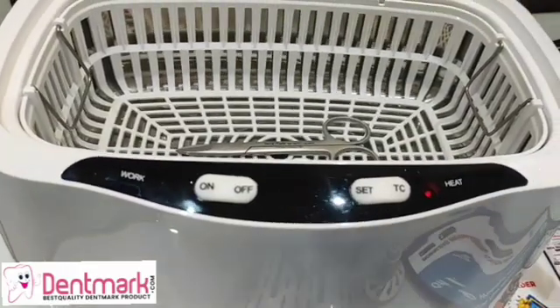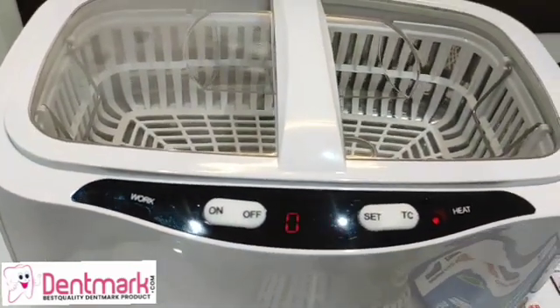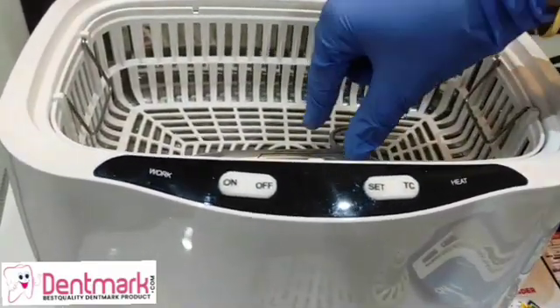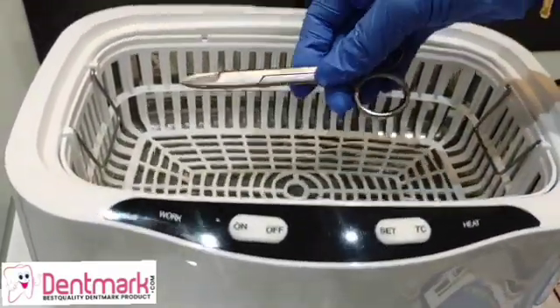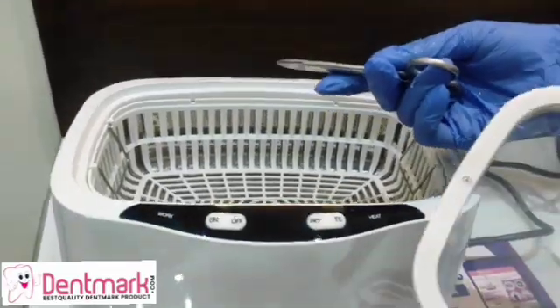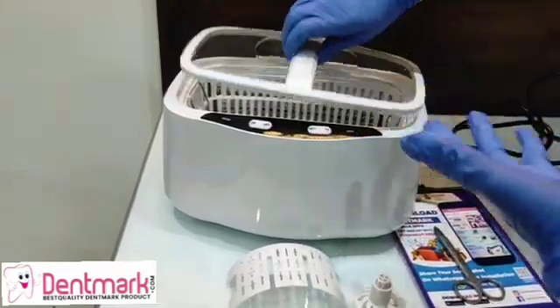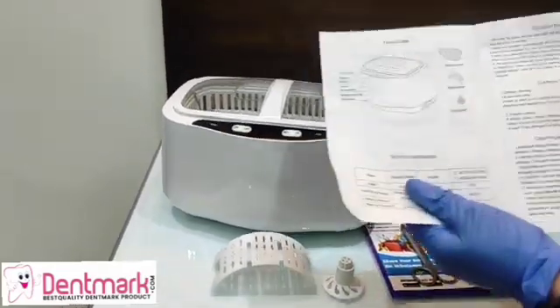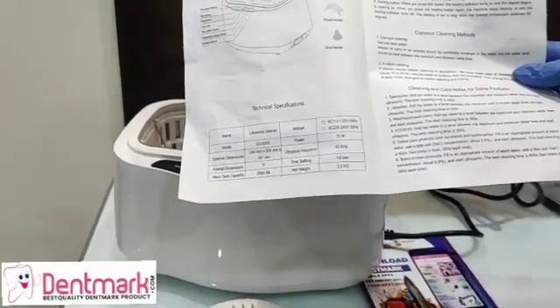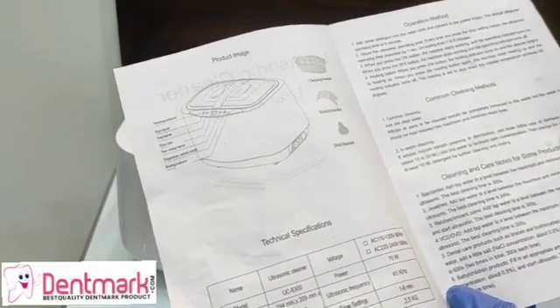Your tool is now sterilized. Once you are done, switch it off — switch it off from the back as well. The water will be slightly warmer once it is done. For your convenience, a manual is provided along with this ultrasonic cleaner, which lists the various timings for spectacles, jewelry, dental products, and many other items.